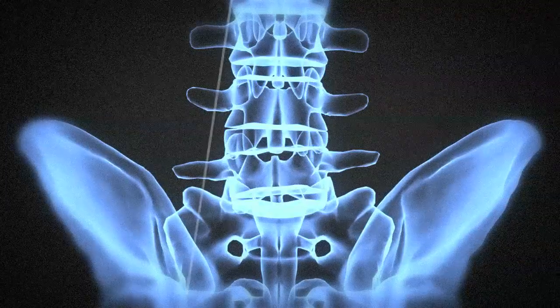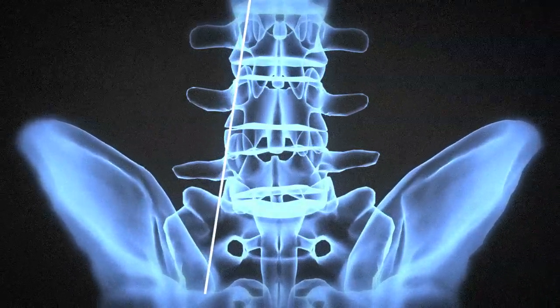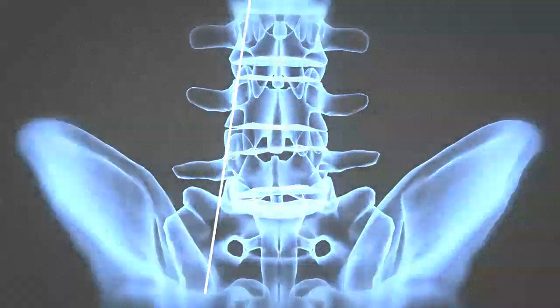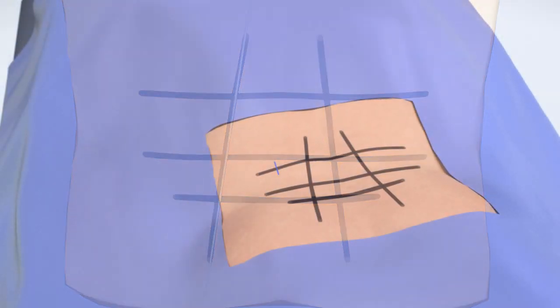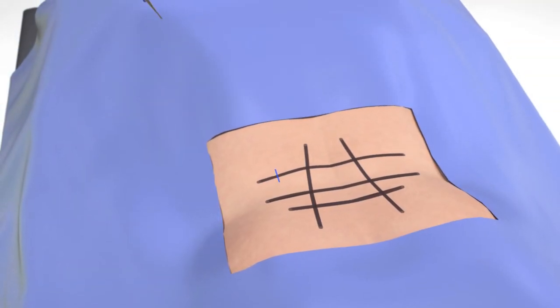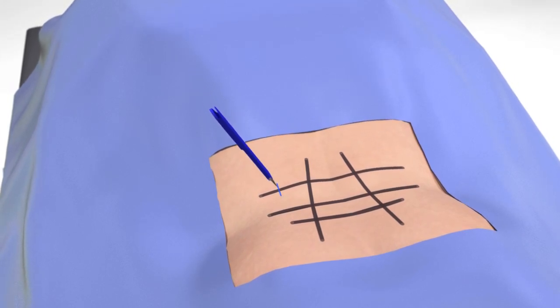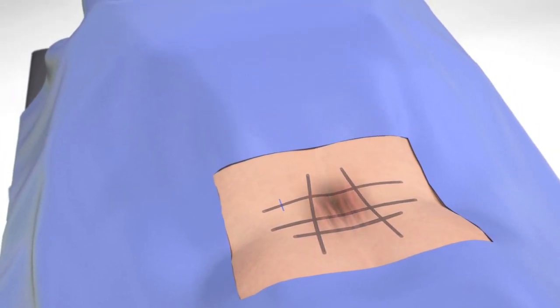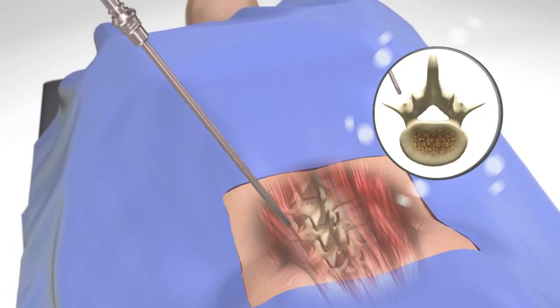Next, use AP fluoroscopy to align the guide wire along the lateral borders of the pedicles to be instrumented. Place the initial incision one centimeter lateral to the intersecting lines. After incising, insert the cannulated awl and dock on the pedicle.